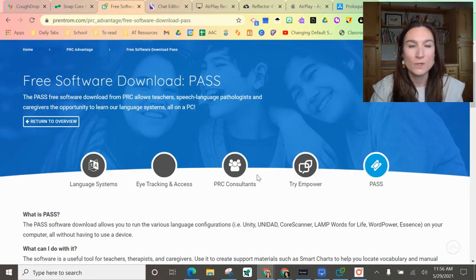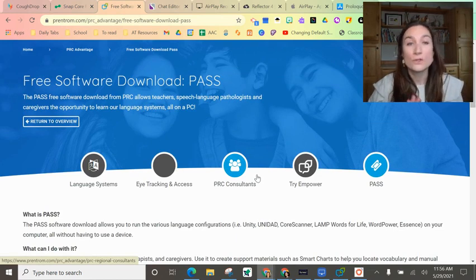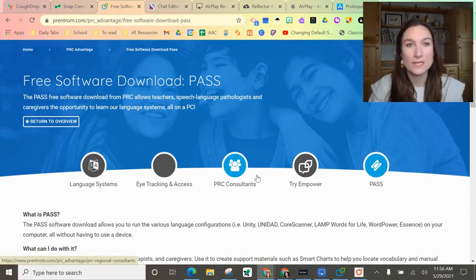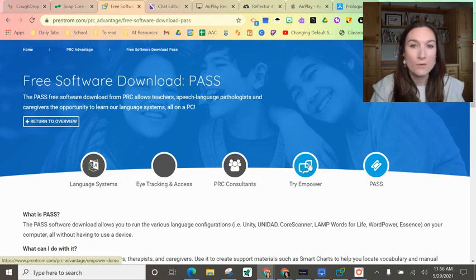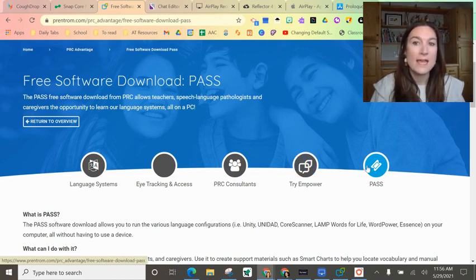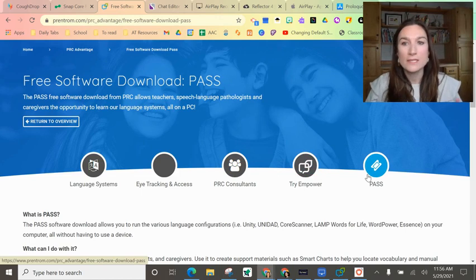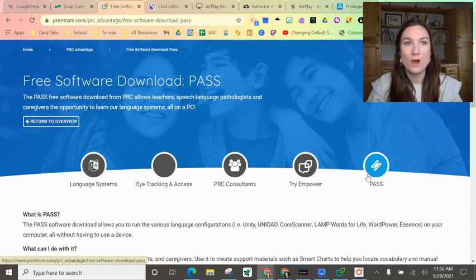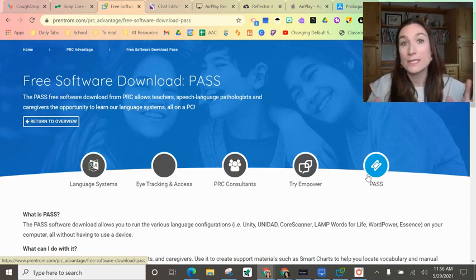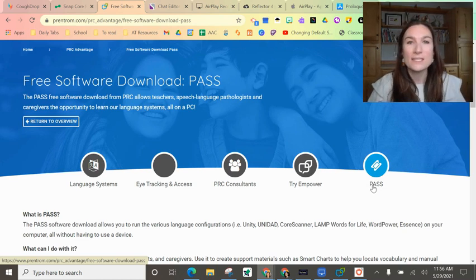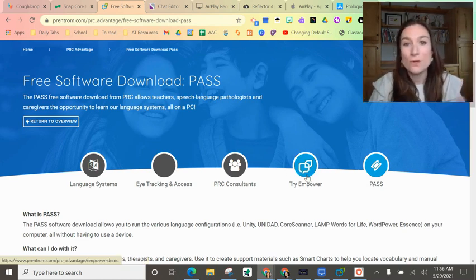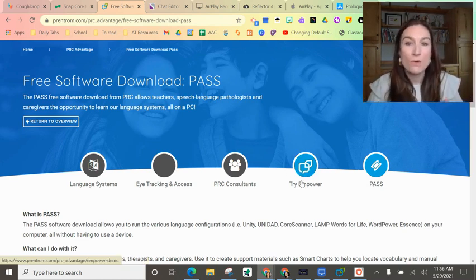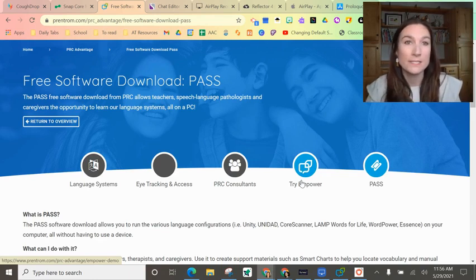Next, we're going to look at PRC. There are two options for getting PRC systems on your computer: Empower, which you would download right here, and the Pass software. The difference between these two is the language system looks the exact same, but Pass is their older platform and Empower is the newer platform, so the toolbox looks a little bit different.